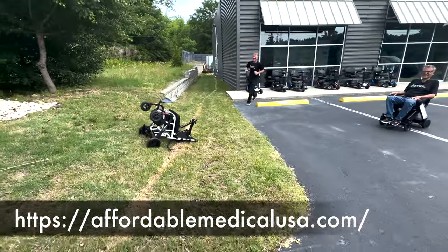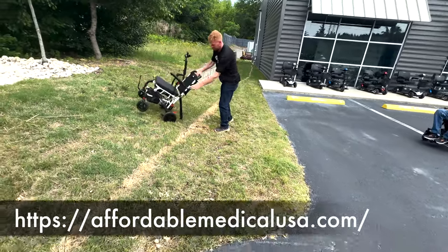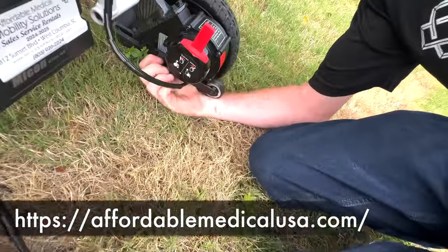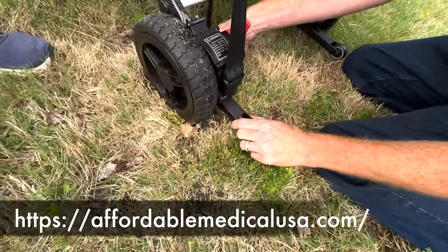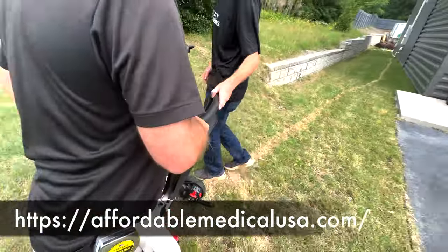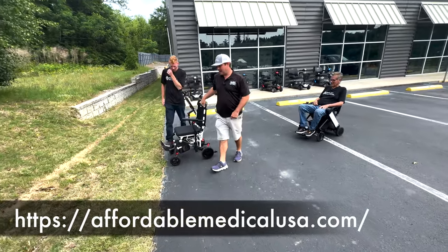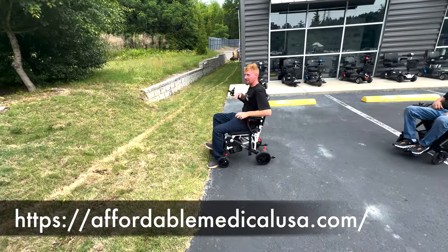Hey, do it again. Take that out though. Make sure the anti-tippers are out. That's crucial. Put the anti-tippers on that thing. Move them out. It's really important to have these out. So there's the reason why, but at the same time, you shouldn't be going up this. But again, if you're riding this for a long period of time, you need those anti-tippers. Tippers out. All right, go ahead.